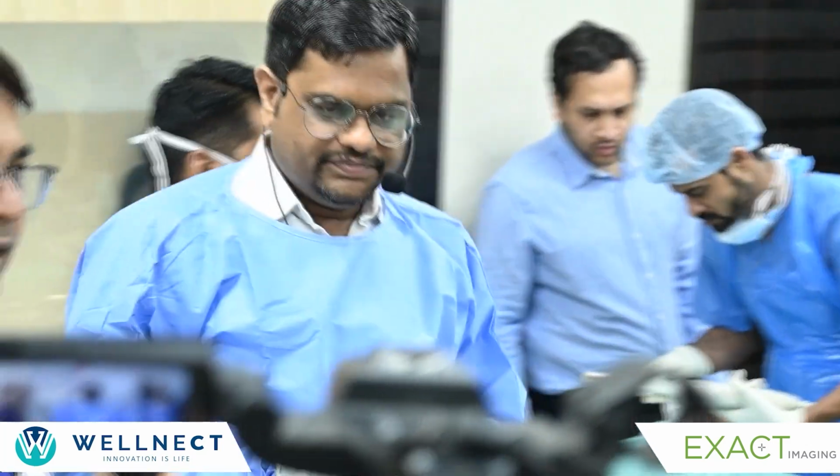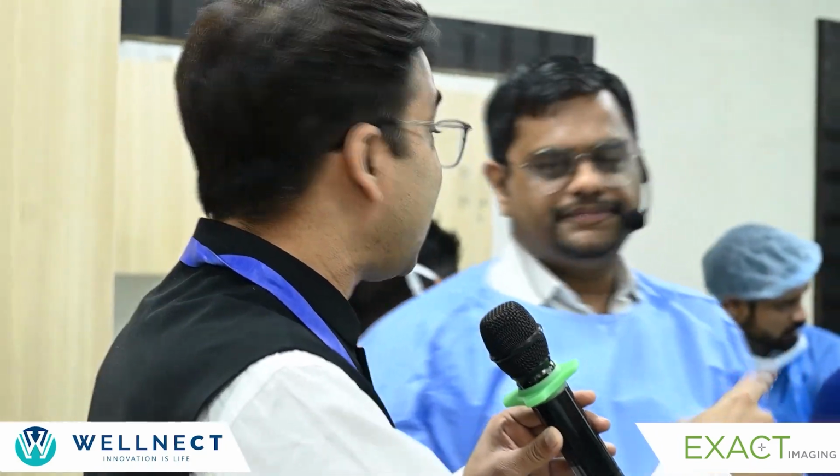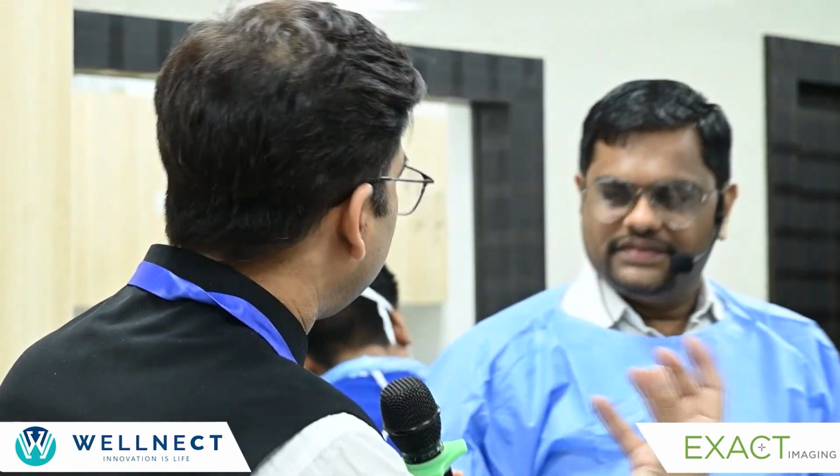One more thing I want to add, when you go through the literature, what I personally found is that whatever biopsy we have done, we can see the tracks there. If you follow this patient in due course of time, these tracks are still visible because of this high frequency, which is not usually visible with the low frequency. They can also help in discriminating. I think this is more of a precision point of view, and if we see properly, probably we are staging it better, diagnosing it better, and it may help us.